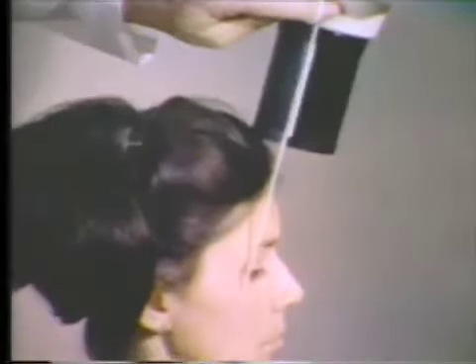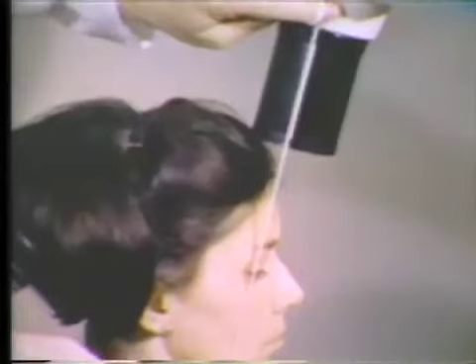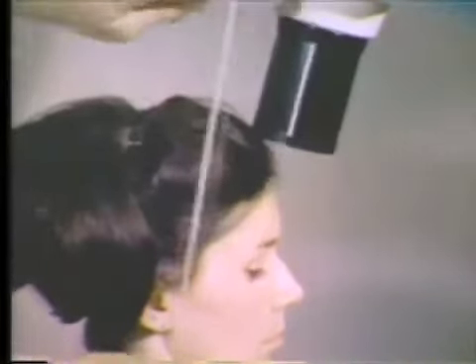This is how the error occurred. Although the central ray passed through the outer corner of the eye, the beam was projected toward the back of the patient rather than forward toward the feet.